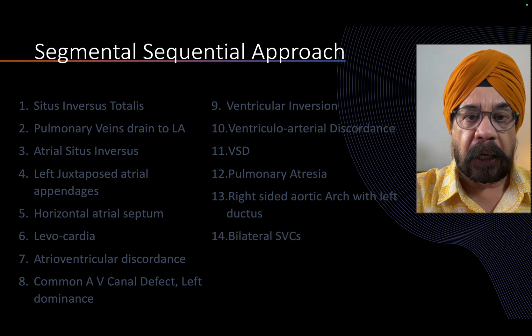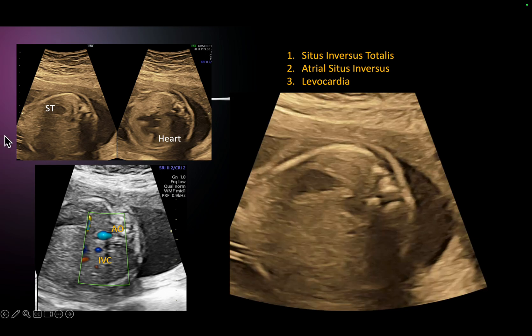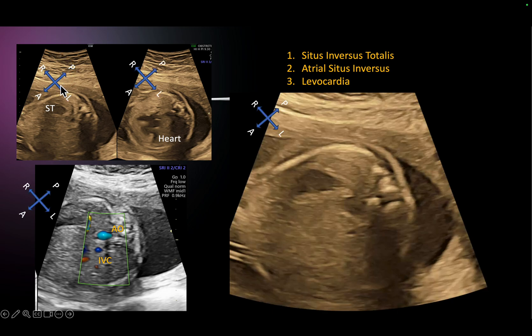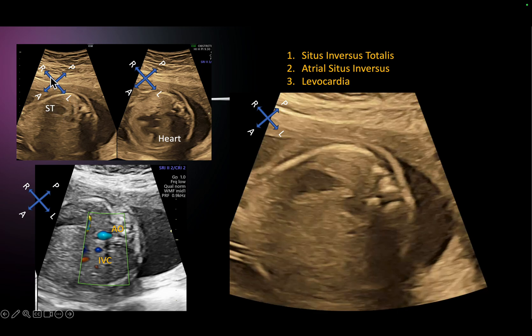Let's begin. This is a cross-section at the level of the stomach. The scan shows the stomach is on this side, while there is a discordance — the heart is on the other side, but the aorta is on this side and the IVC is on the other side. The stomach, aorta, and umbilical vein go in an anti-clockwise position. The head of this fetus was caudal, which indicates the stomach is on the right side of the fetus, according to our clockwise method of assessing fetal situs.